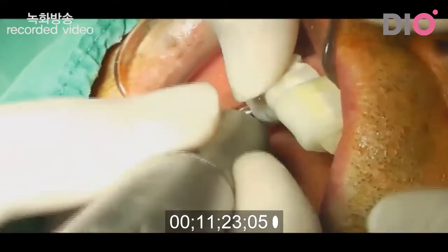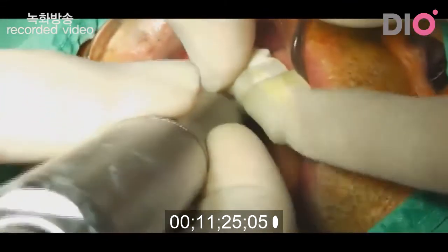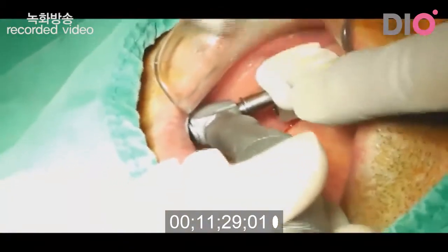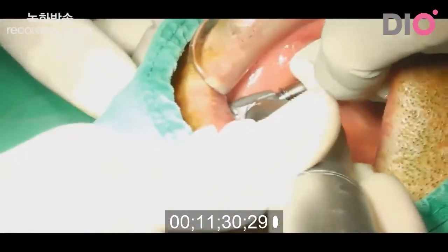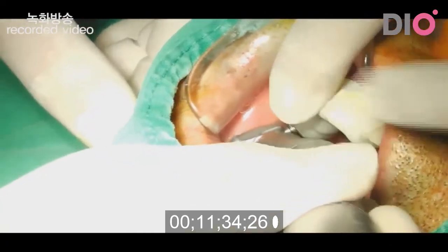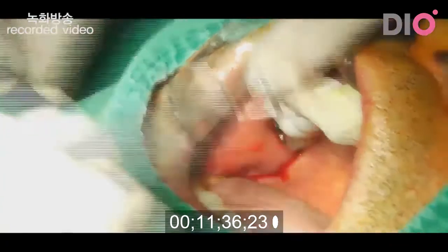The surgical guide should be in secure position. Yes, and then in the first molar as well, you can see here. The insert into the sinus cavity. Okay, that's it. And then I remove the surgical guide again.